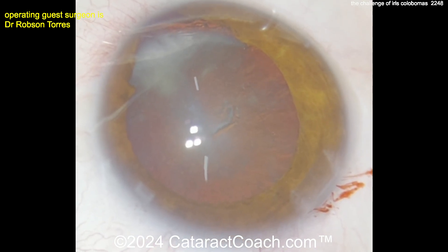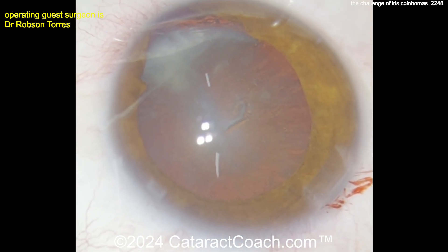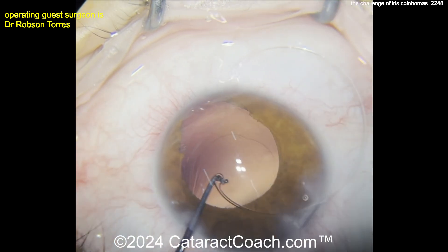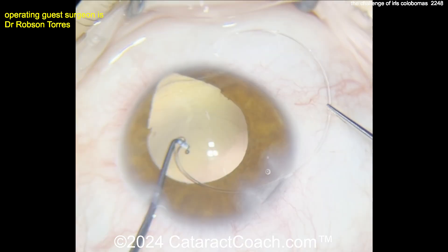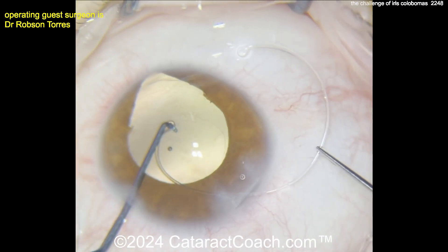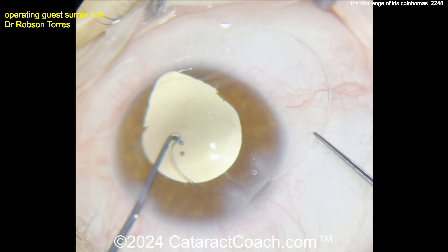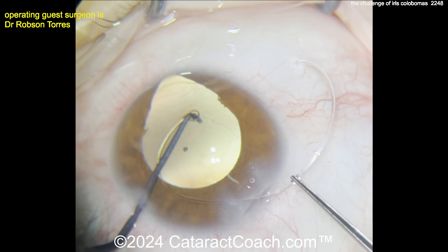Looking at this case, there's the cataract. Removing the cataract is actually not the most difficult part of the case. We have a good-looking capsulorhexis, and here comes a capsule tension ring. The left hand uses a Sinskey hook to help guide the leading eyelet of the CTR, while the other hand slowly feeds in the CTR.